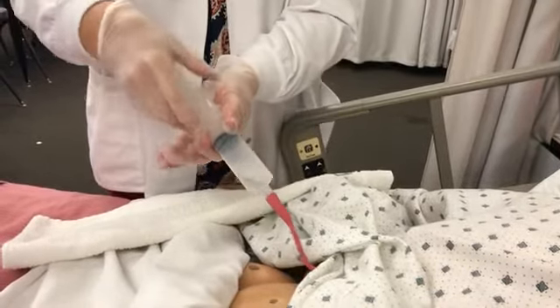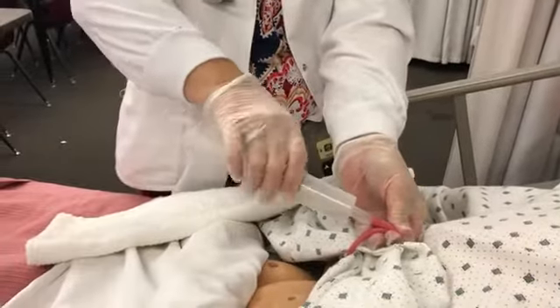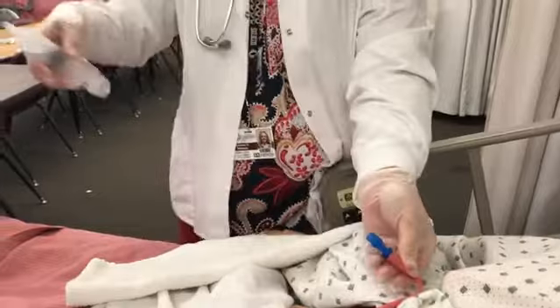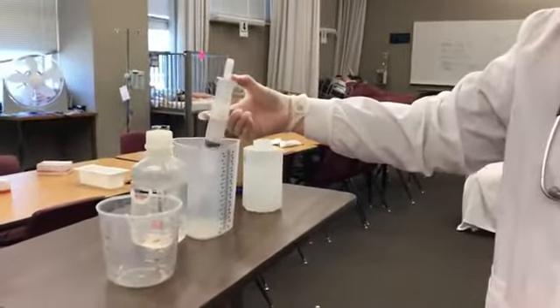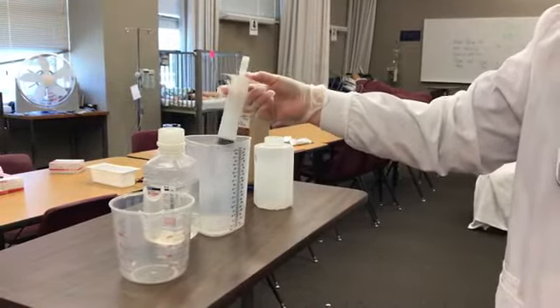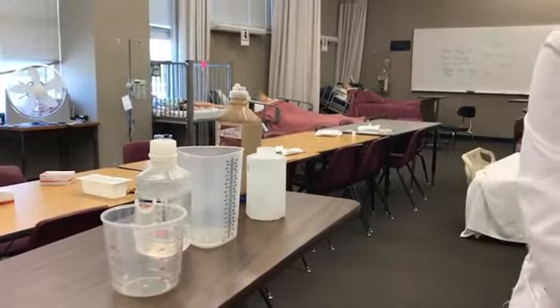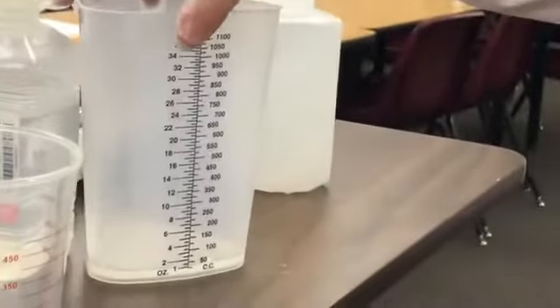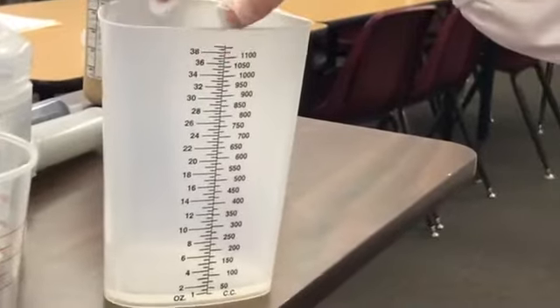It's going to be important to measure this, so clamp it off, disconnect it. I'm just going to hold this here for just a moment because I need to measure it in our container over here. Sometimes it's best to use a smaller container. So I will chart that my client has, we can say that that is probably about 25 cc's of residual.